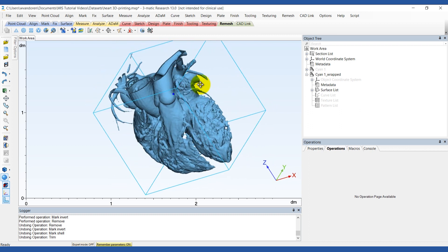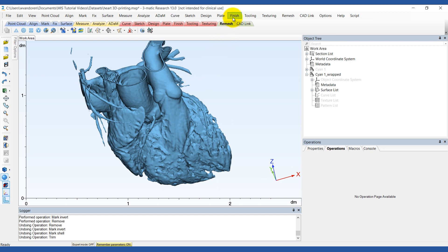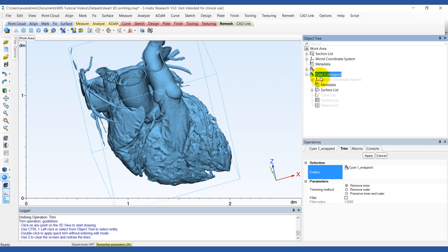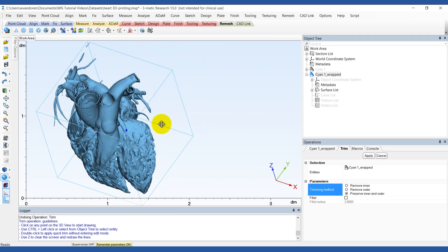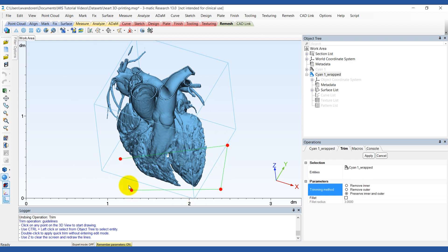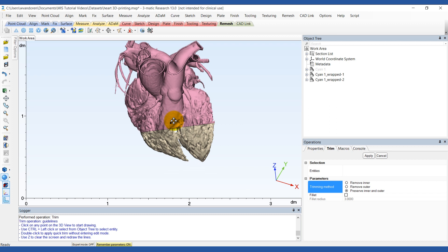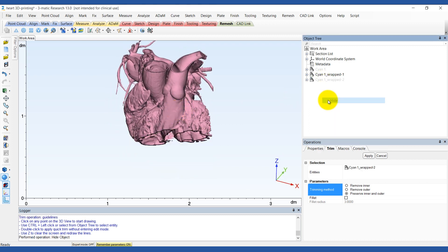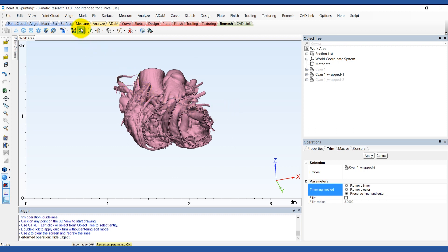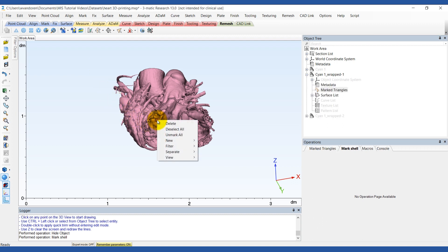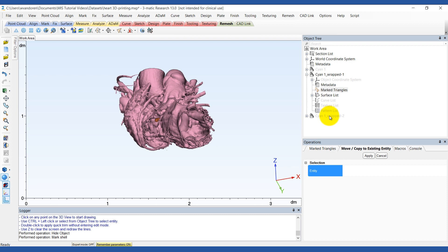If you want to separate the ventricles and print the model in two different pieces, you can use the Trim tool for this as well. This time, check the box Preserve Inner and Outer instead of Remove Inner. Now you can see that you have two separate parts. If you want to keep the leftover floating shells, you can mark them using the Mark Shell tool. Right-click on them, go to Separate, Move to Part, then choose Existing and choose the other part to move that shell to.